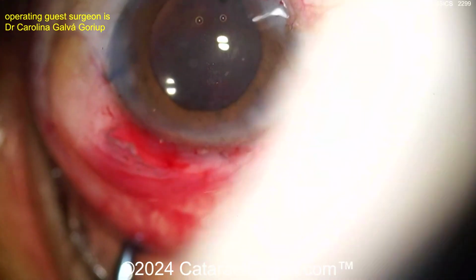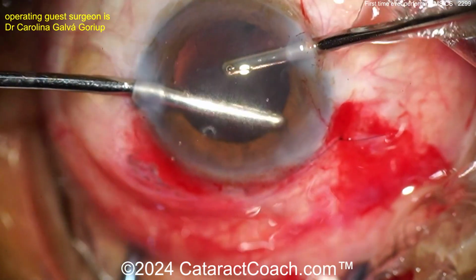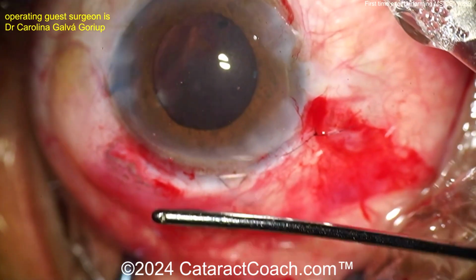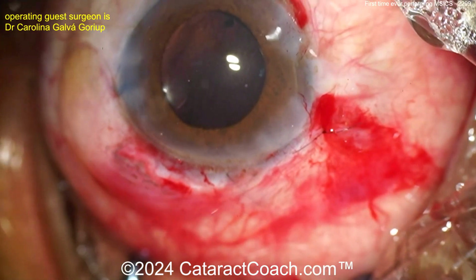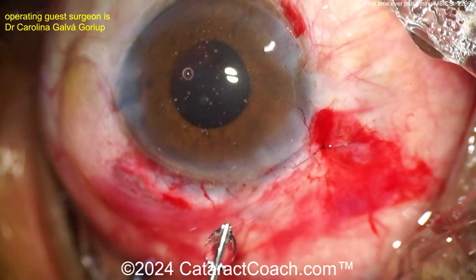Very good. And now going in bimanual, remove that viscoelastic. Can you imagine how happy this patient's going to be? The cornea will be totally clear the next day. Wow, it's just a cool procedure. You definitely need to learn MSICS. Do yourself a favor, learn it, love it.